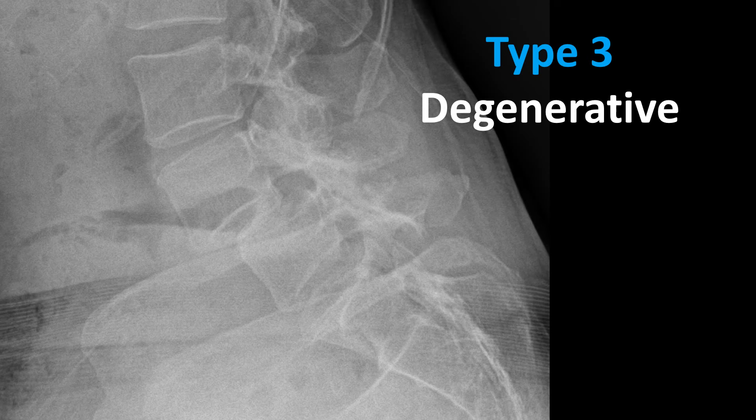The third type on the Wiltse classification is degenerative spondylolisthesis. This is due to severe long-standing degenerative arthrosis, typically moderate to severe, usually in the facet or zygapophyseal joints of the lumbar spine. That arthrosis contributes to the anterior translation. Here is an anterolisthesis of L4 with severe facet arthrosis posteriorly, and the entire L4 vertebral segment — including the spinous process — has moved anteriorly.